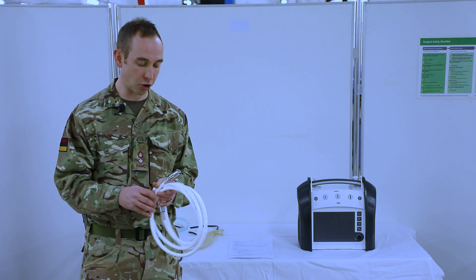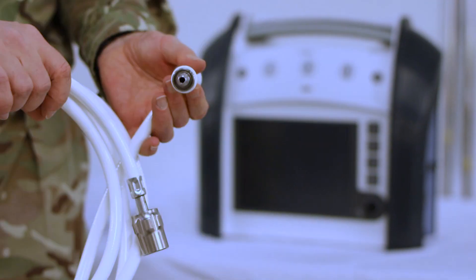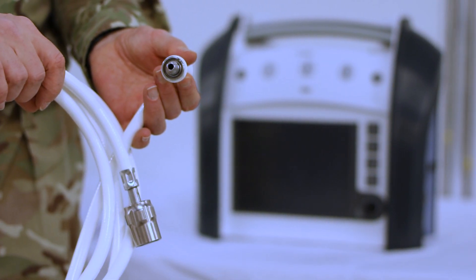The last component of this is just to do a physical check of the non-interchangeable screw thread and the Schrader valve itself, which will ensure that there's no damage to these.